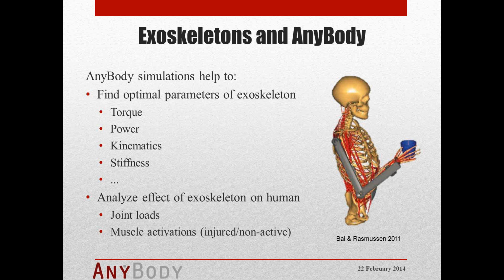And in an Anybody simulation, it's very easy to simulate an injured muscle or a non-functional muscle. So you can also simulate patients with the Anybody modeling system. Especially in the rehab process, you can evaluate how this exoskeleton will help during the rehabilitation process of the patient while he wears an exoskeleton.